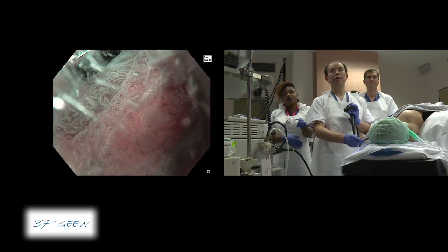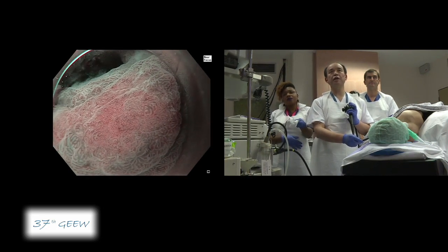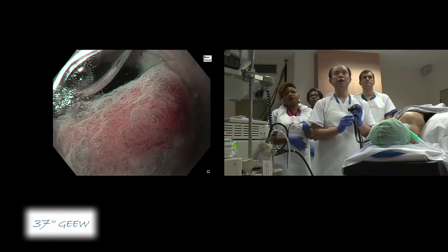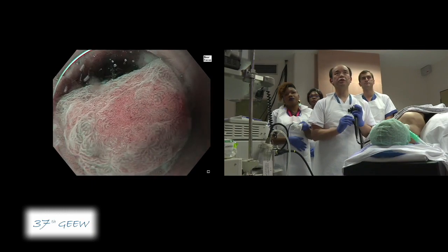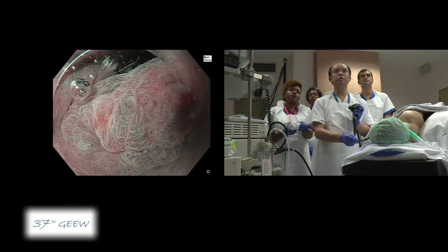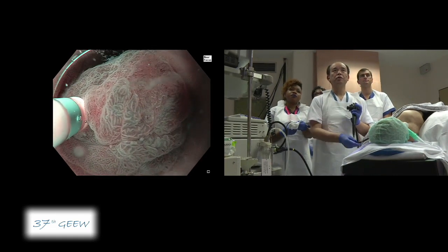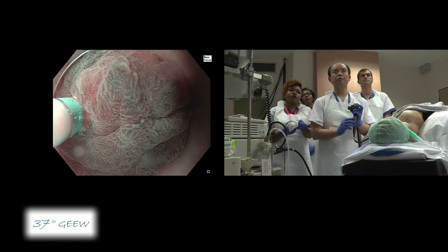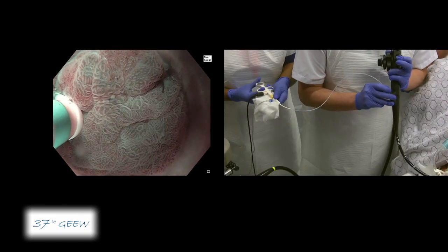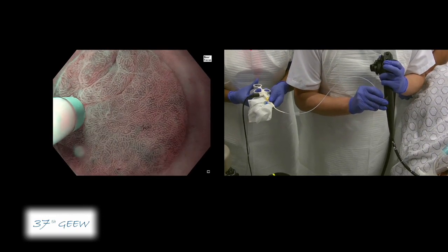To observe this area more clearly, I would like to flush and wet it a little bit to avoid light reflection, giving us a much clearer view. Before starting the actual ESD procedure, I would like to place marking dots around the region using the tip of the Dual Knife J. The underwater condition is very good to visualize the target region more clearly. Gently touching the target tissue with the closed tip of the Dual Knife, I can place the marking dot precisely.